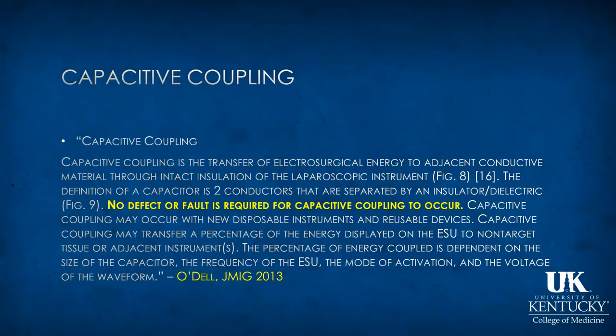It's interesting to learn that no defect or fault is required for capacitive coupling to occur. And there are a number of factors which influence the amount of energy and perhaps the part of the patient which is injured. Very complex and somewhat abstract, I will have to agree.